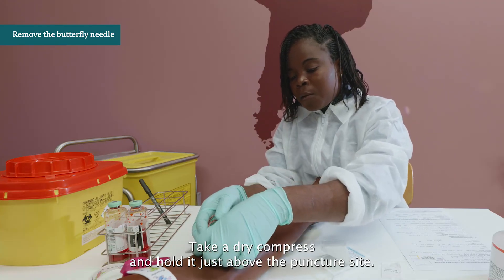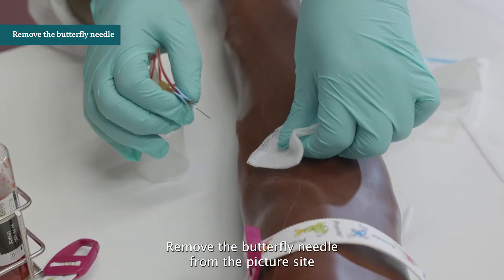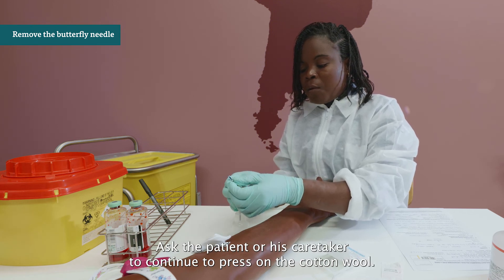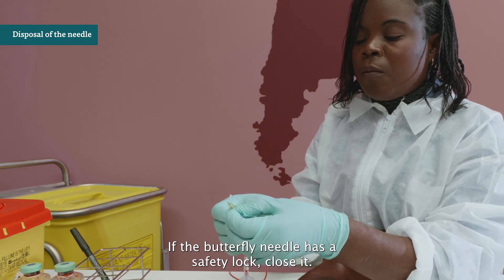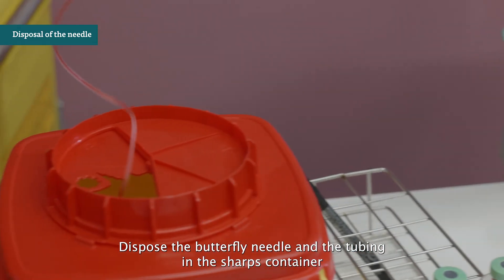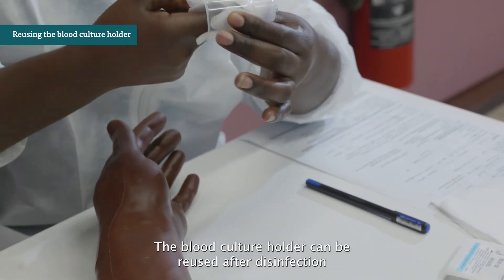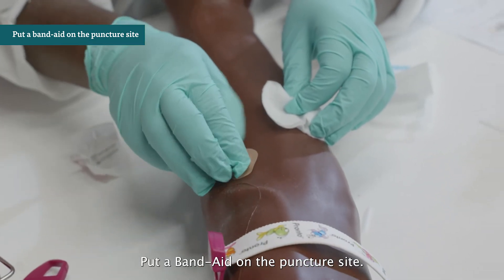Take a dry compress and hold it just above the puncture site. Remove the butterfly needle from the puncture site and press the dry compress on the site as soon as you have removed the needle. Ask the patient or caretaker to continue pressing. If the butterfly needle has a safety lock, close it. Dispose of the butterfly needle and tubing in the sharps container and unscrew the blood culture holder. The holder can be reused after disinfection if not visibly soiled. Put a band-aid on the puncture site.